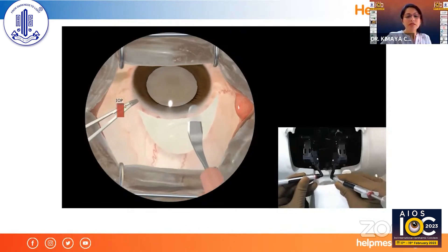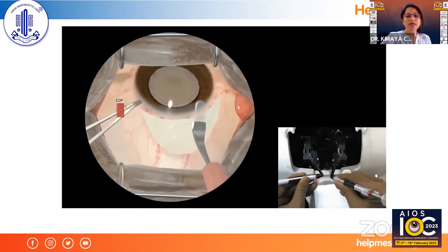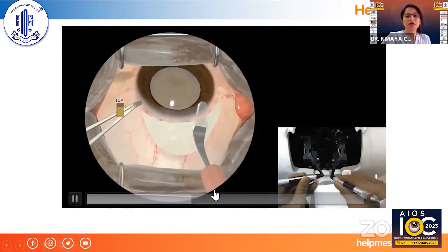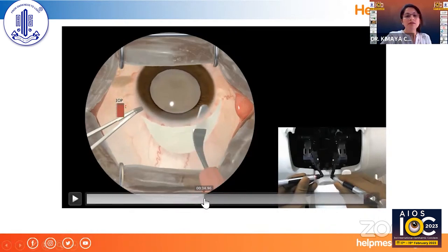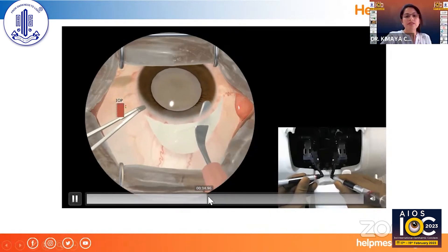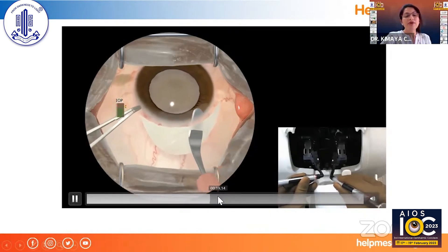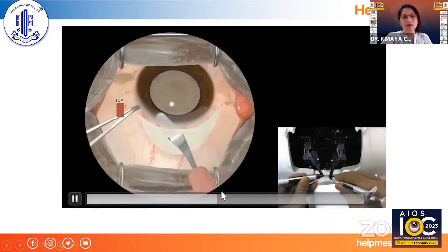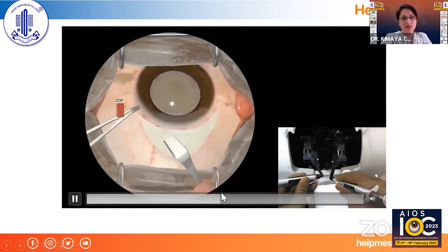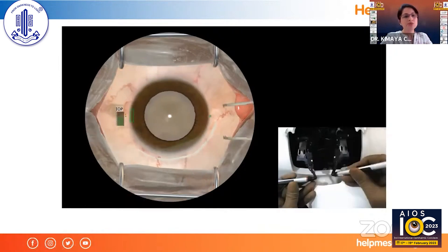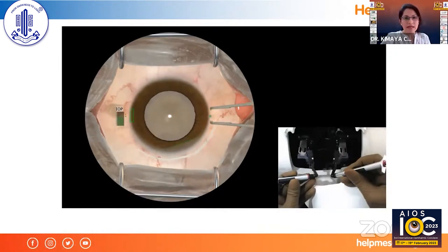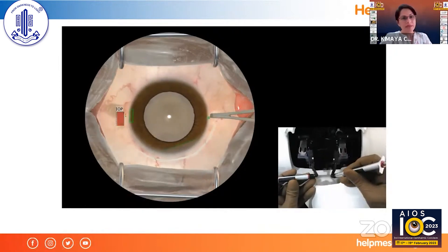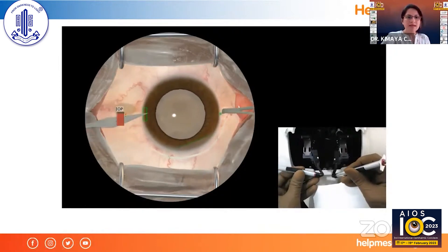The tunnel is now complete. If there is a complication like buttonholing or lateral laceration of the tunnel, the instruments will turn red and you have to re-attempt and start with a new eye immediately.